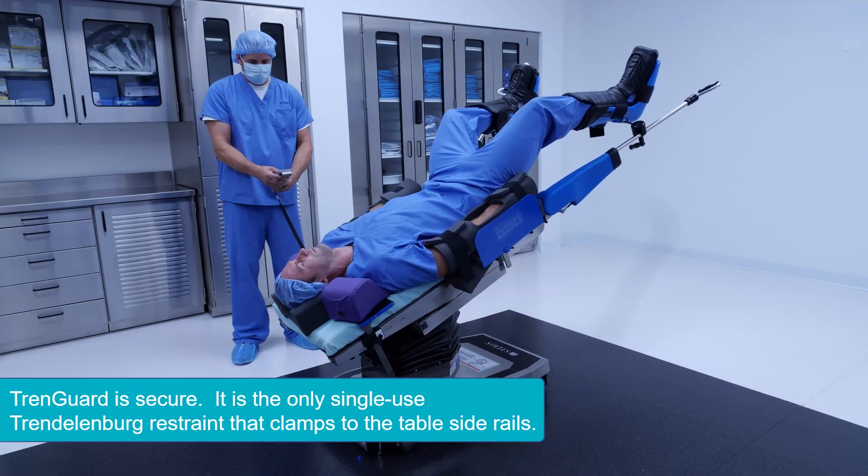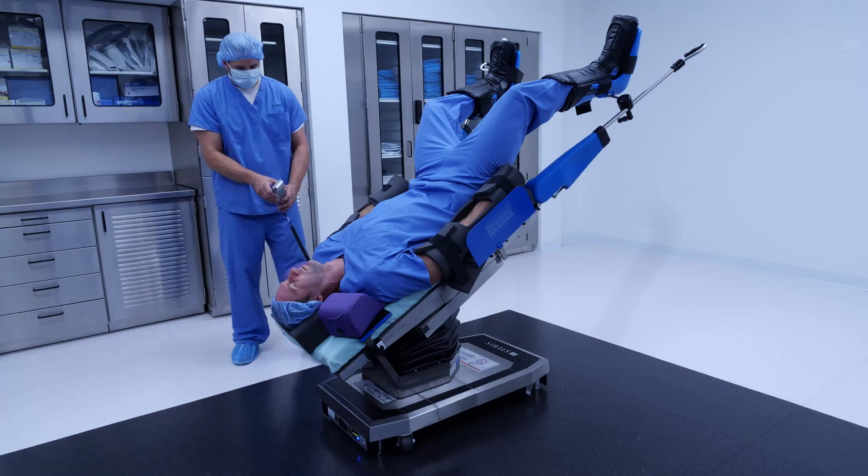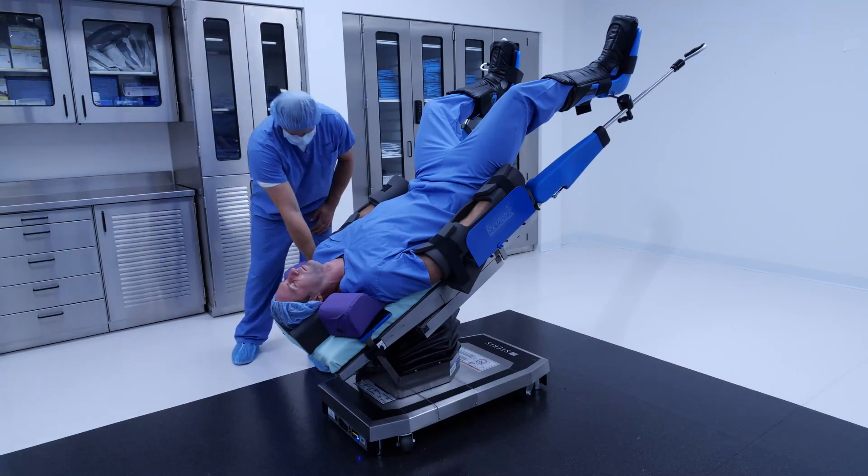TrendGuard is the only single-use Trendelenburg restraint with a hard connection to the table side rail. Other devices utilize a soft strap, which can slip on the rail and slide down the table.